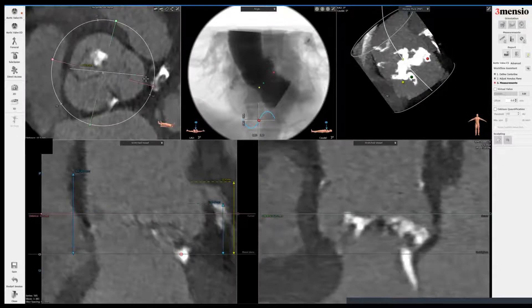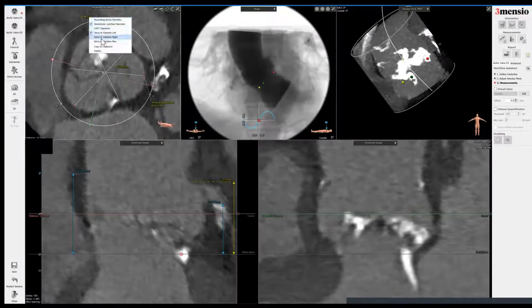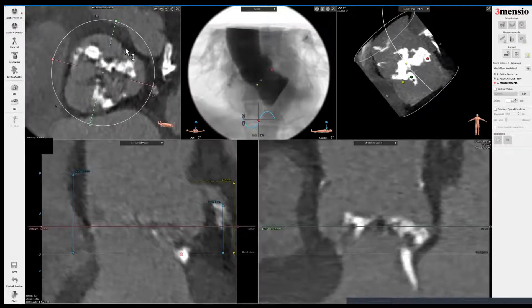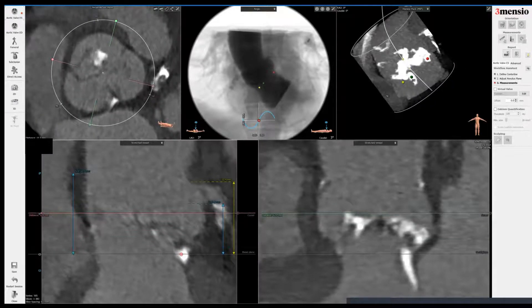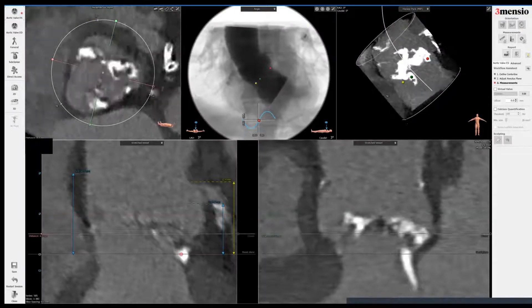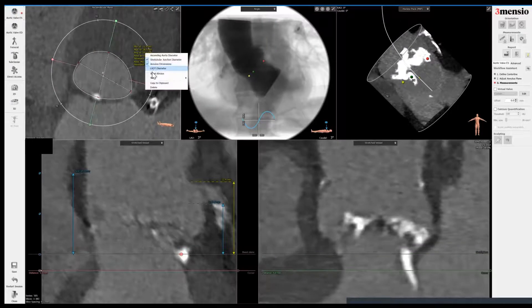Then I cut into half of the sinus height to get my sinus of Valsalva dimensions. I click on the ruler and go from one commissure to the left sinus, right sinus, the opposite commissure, and then the non-sinus to one of the other commissures. I label them the left sinus, right sinus, and non-sinus. It's important to make sure you are oriented properly — you want to be able to see the raphé and where it is located, so you can match the sinus and the commissure correctly, making minor adjustments as needed.